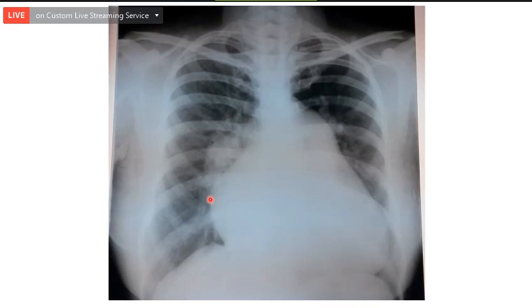Okay, right, yes. Any evidence of left atrial enlargement? Sir, actually, the left part looking straight after the pulmonary bay area. So I don't think it is straight. I think it is coming down and then, see, you are not able to see distinctly the left atrial appendage. You should be able to see here it has come down and then it is going straight. So you are not able to see any prominence.